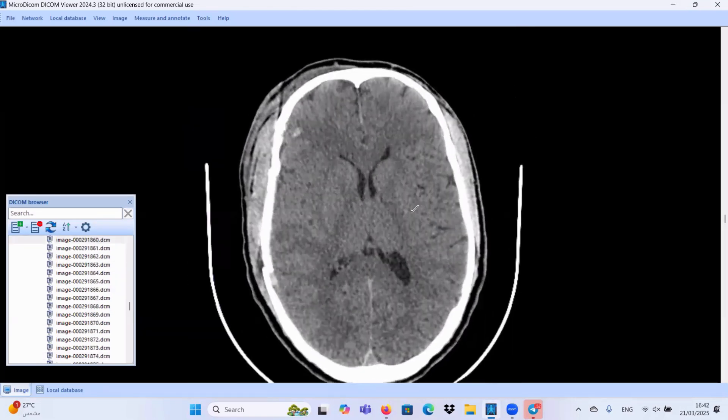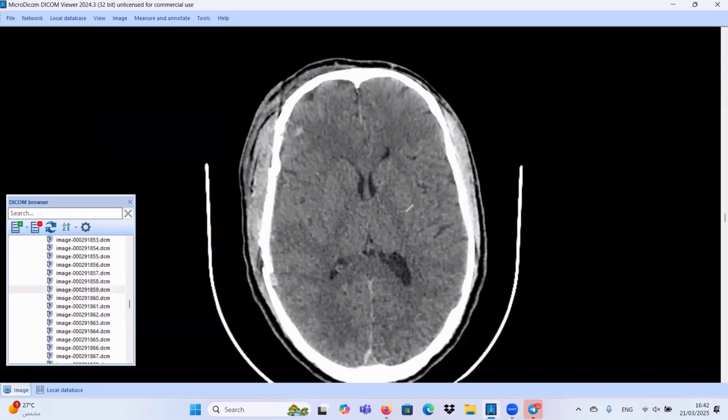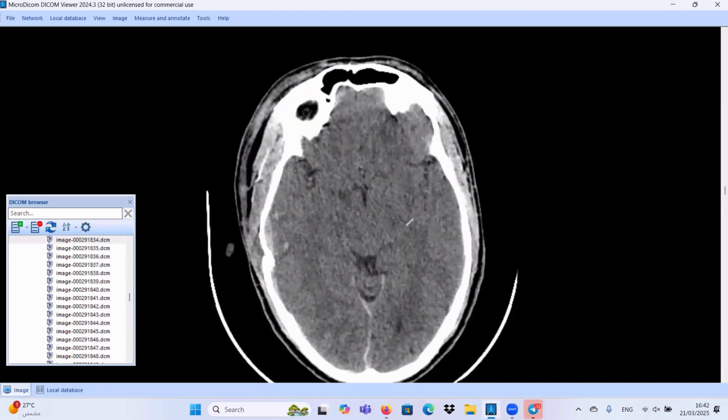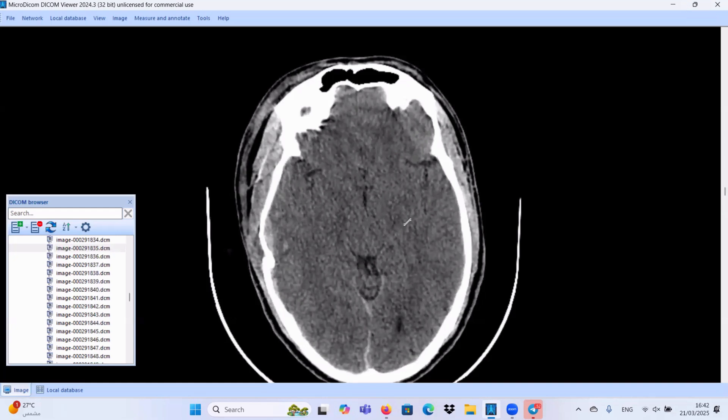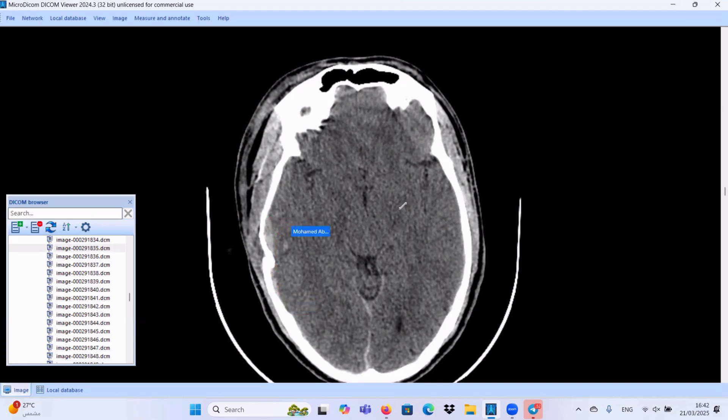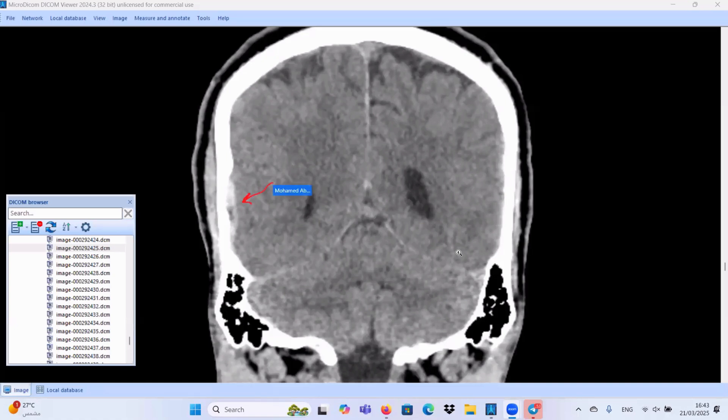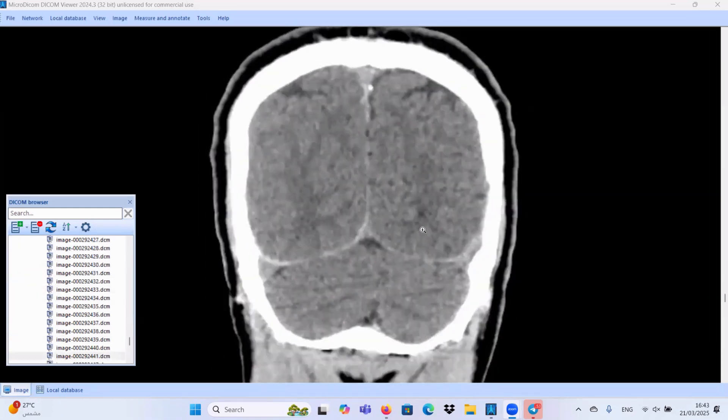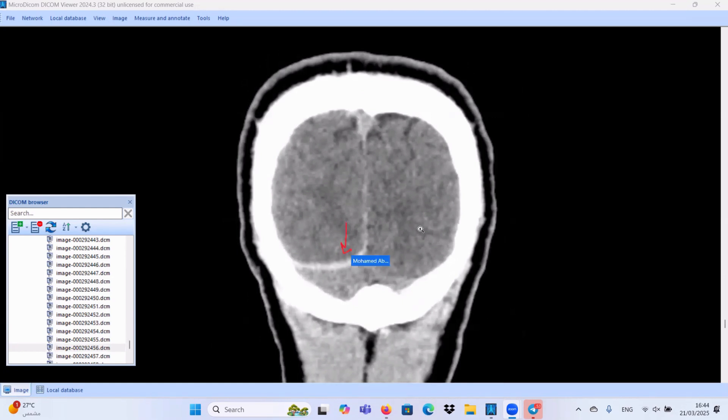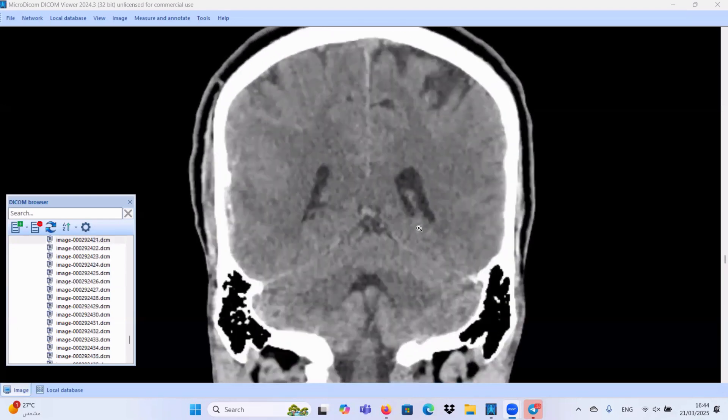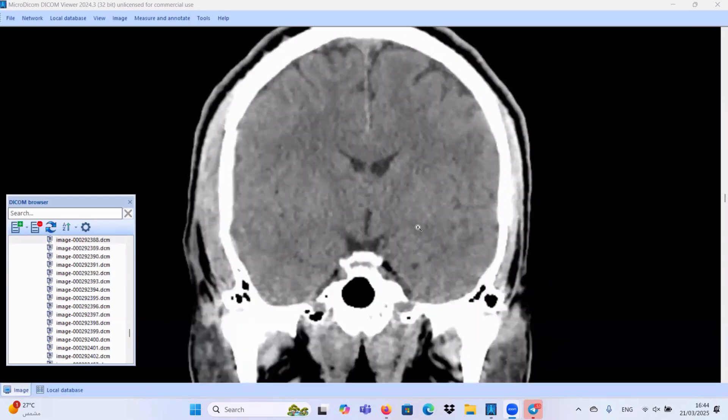We did follow up for the case in the second day and I think the brain contusions are more obvious. And I think the subdural hematoma is progressed in size. I think it is more obvious now. In the coronal plane, as you can see here, the subdural hematoma becomes larger in size. And also, if we trace the tentorium leaflets, the right side tentorium leaflet is expanded by the extension of the subdural hematoma. So, we have for sure evidence of mild progression in size of the subdural hematoma.